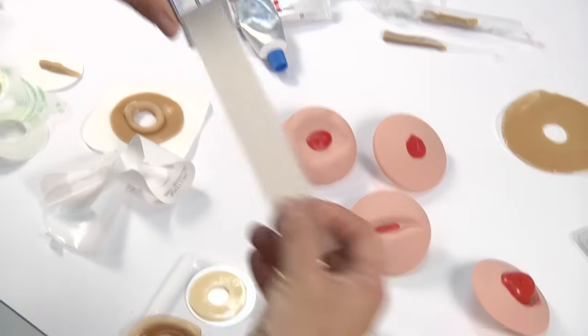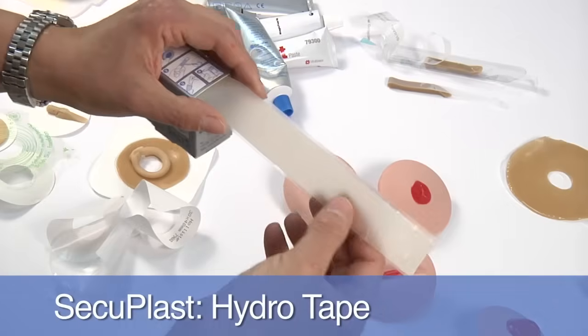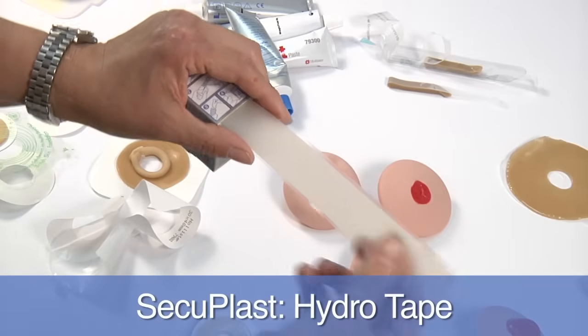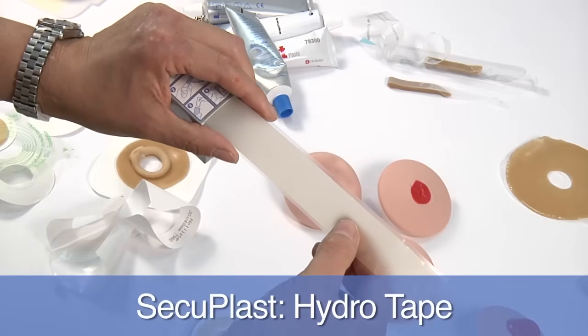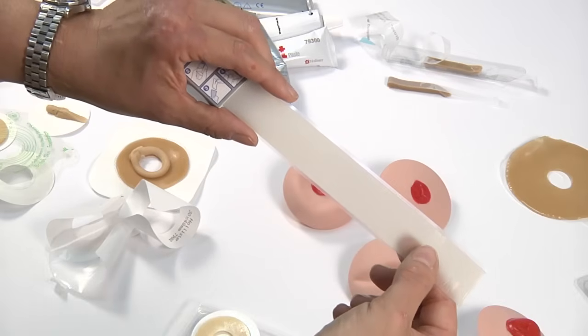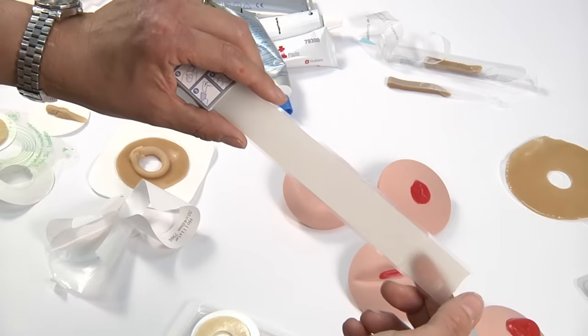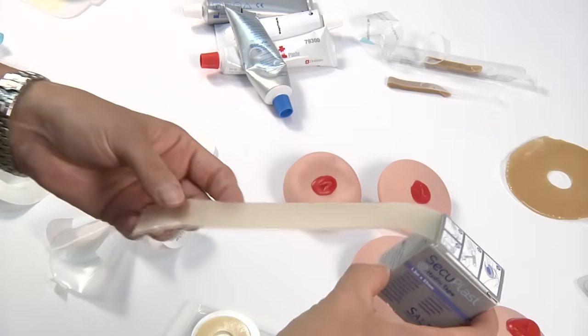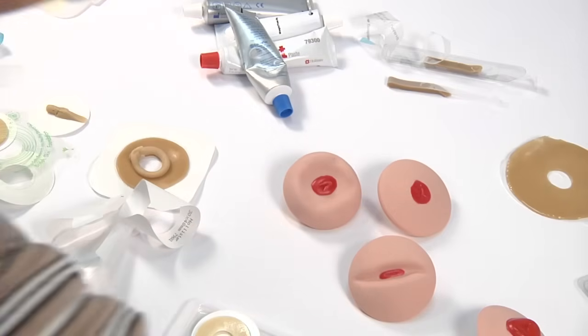And there's a hydrocolloid as a strip, so again you have multiple places where you can dose it, and this may be good for using over a little area that might be ulcerated, and you're using it to secure a dressing over top of that peristomal ulcer. Actually even good for peri-wound skin protection.